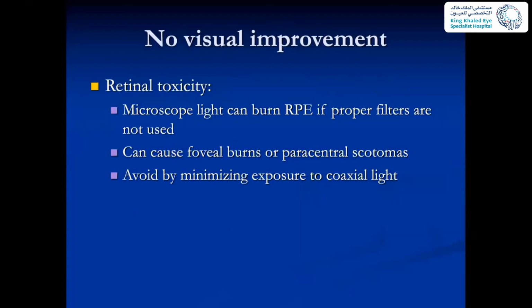If there is no visual improvement after surgery, despite that we looked over and found there is nothing, it might be due to retinal toxicity, and it can be due to prolonged microscope light. It is assumed that it can burn the RPE if proper filters are not used, and it can also cause foveal burn and paracentral scotoma with this prolonged use. And we can avoid this by minimizing exposure to coaxial light.